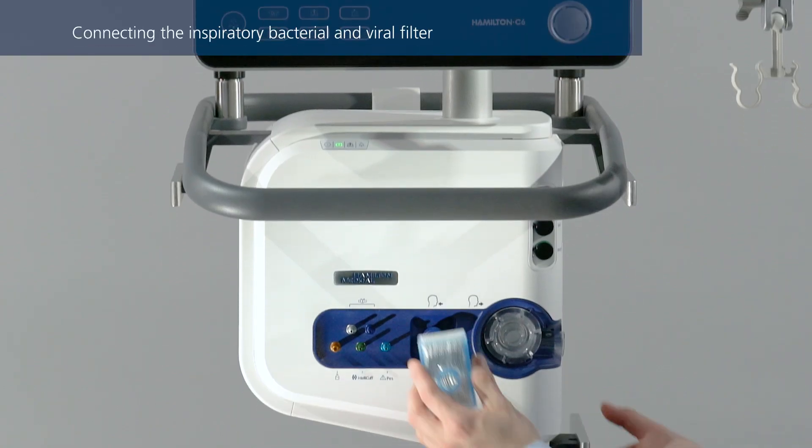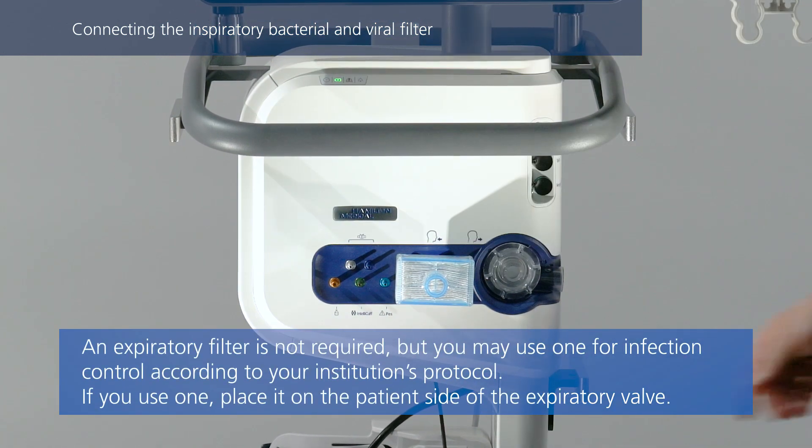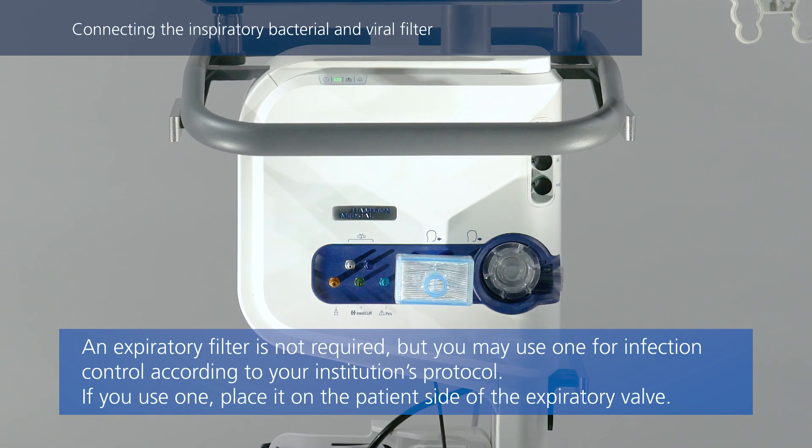To prevent patient or ventilator contamination, connect a bacterial and viral filter between the patient and the inspiratory port.